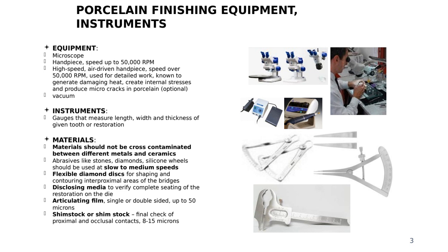Because sometimes if you look at the way some technicians design a groove, a groove for them is just like a scratch. They take an instrument and they just cut a line into it. That's not a groove. Okay? A groove is like a valley, right? It goes up and down and it's rounded on the side. It's more like a V instead of just like a chunk.